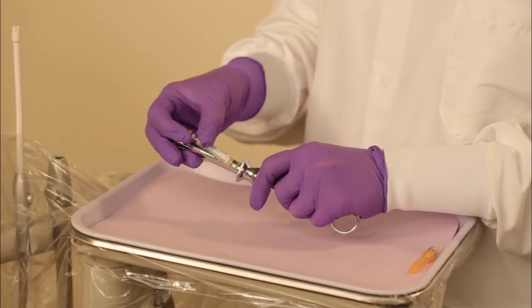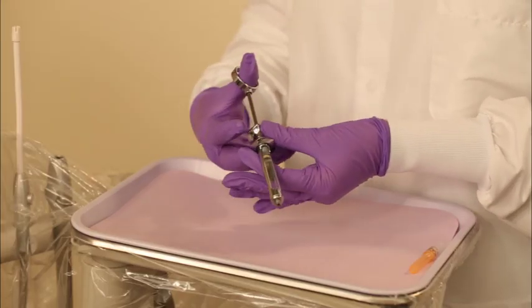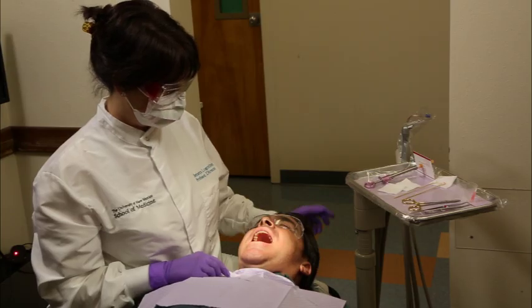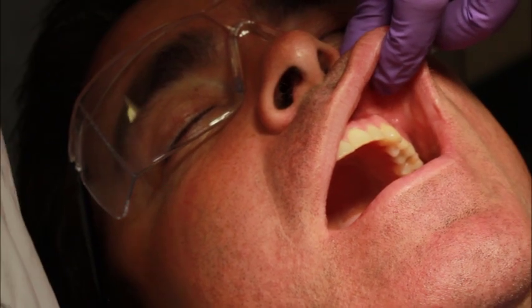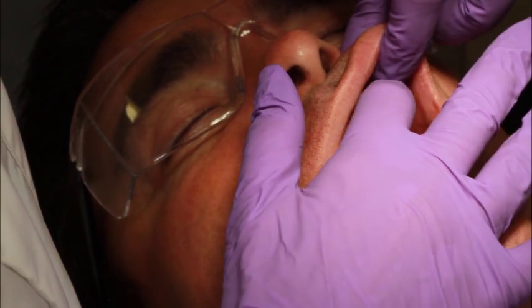Load the local anesthetic syringe as demonstrated in the procedure, loading the metallic or plastic cartridge-type syringe. Before injection, follow all steps as demonstrated in the procedure, basic injection technique. Assume the correct operator position according to the area to be anesthetized. Ask the supine patient to open his mouth and then retract the upper lip, pulling the tissue taut using the thumb and index finger of the non-dominant hand, one inside and one outside. You may use a piece of sterile gauze to help retract slippery tissue.